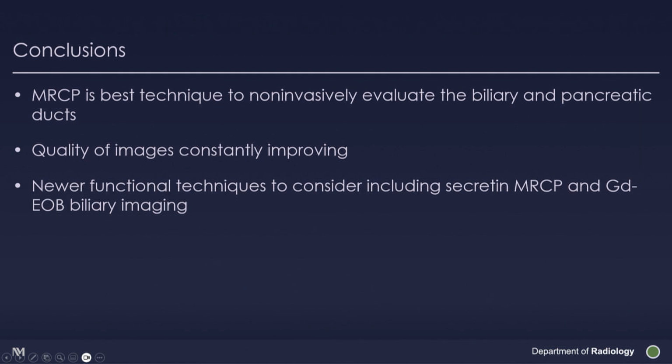So in conclusion, as I mentioned, I think MRCP is the best technique to non-invasively evaluate the biliary and pancreatic duct. The quality of the images is constantly improving, and there are newer functional imaging techniques to consider, including secretin MRCP and Gd-EOB biliary imaging.